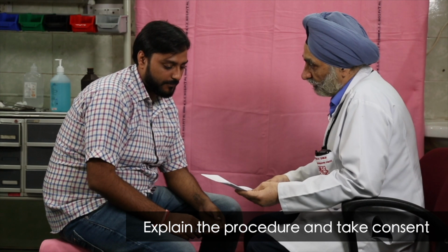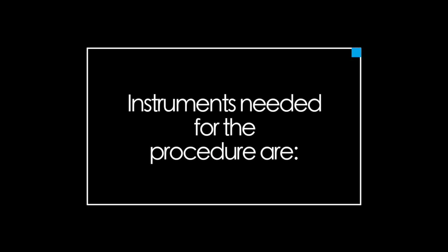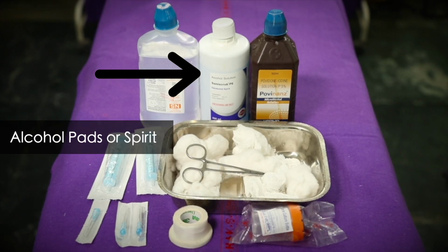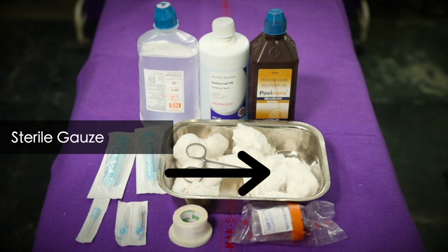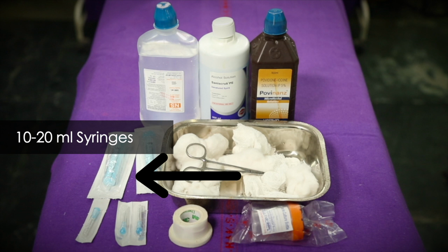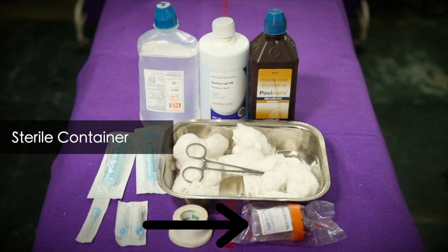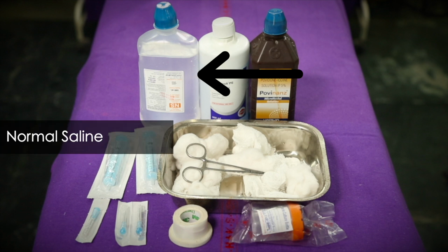To begin with, explain the procedure and take consent from the parent or guardian. Instruments required for the procedure are sterile gloves for cleaning, alcohol pads or spirit, povidone iodine, and sterile gauze. For aspiration, 10 to 20 ml syringes, 21 to 23 gauge needles, and sterile container are needed. Cotton and adhesive tape to clean and dress the aspirate site. If quantity of aspirate is small, saline will be required to ensure that specimen doesn't dry out.